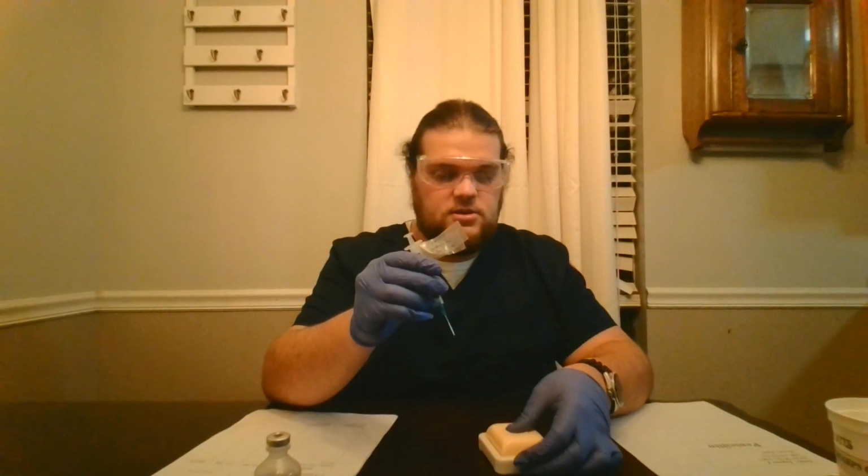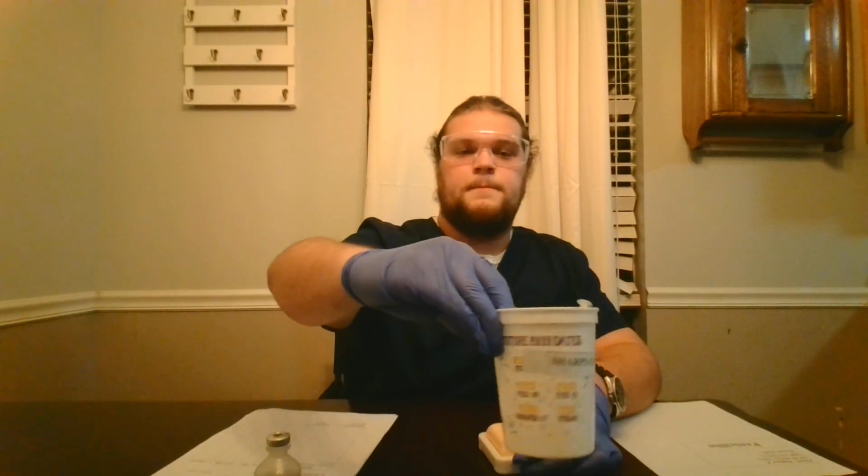All right, I'm going to pull out and hold pressure, making sure not to massage. I'm going to place my needle and syringe into my sharps container. All right, after applying pressure, I'm going to stop applying pressure. I'm going to take off my gloves properly, glove to glove, and skin to skin, and dispose of them properly. I'm going to take off my goggles, and I'm going to perform hand hygiene.